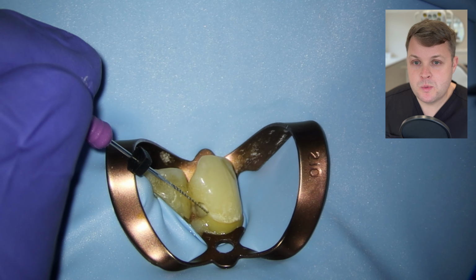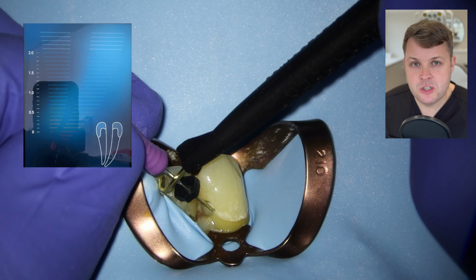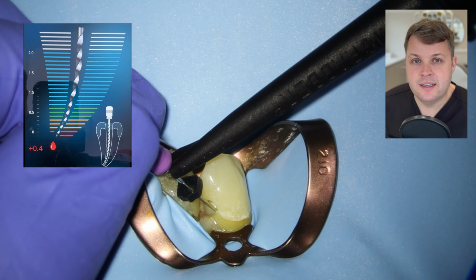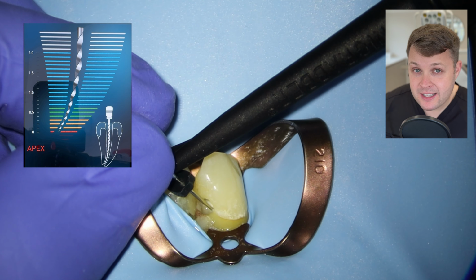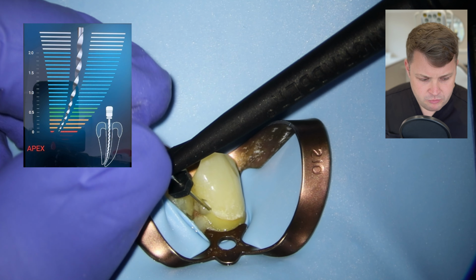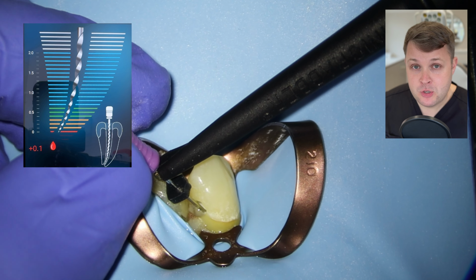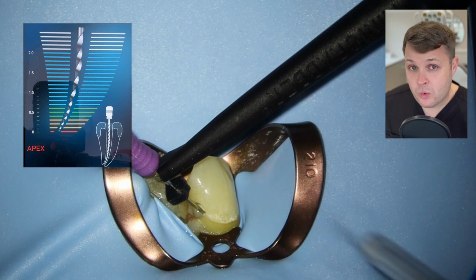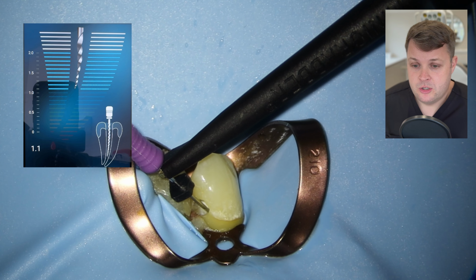And then once we've opened up the canal space, I'm going to just use my extra long 31 millimeter size 10 K file, and then I hook it up to the apex locator, seemingly think that I'm at zero, but as I withdraw this hand file, I notice that I'm just at zero all the time, and actually what I do realize is, because the access cavity is so close to the coronal aspect of the tooth and it's touching the gingival tissues, that the liquid from the access cavity is shorting out.